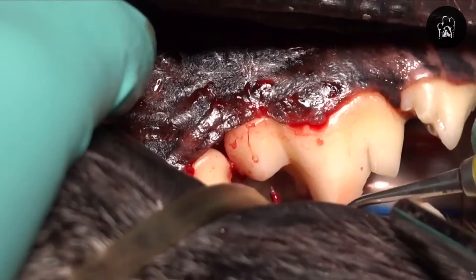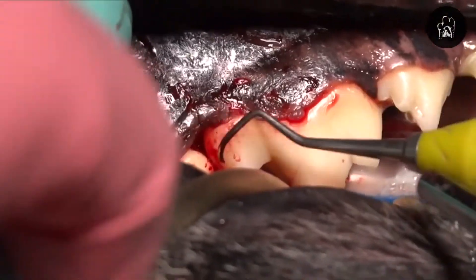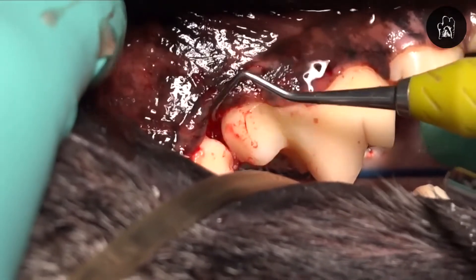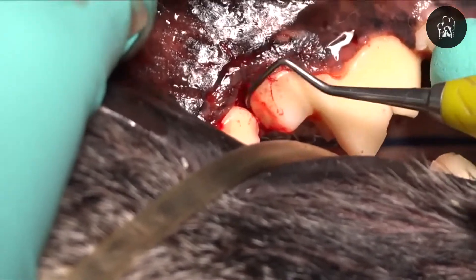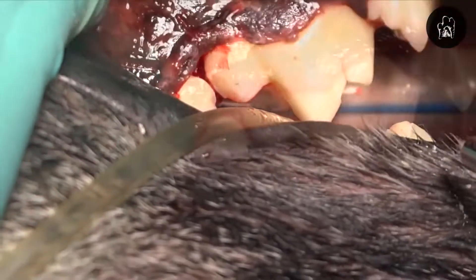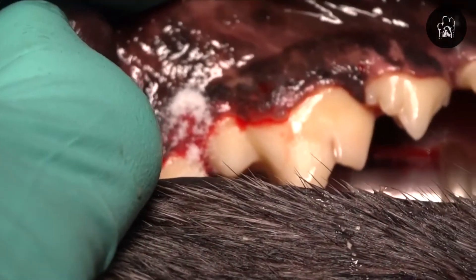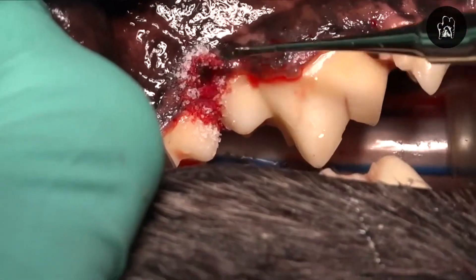By removing that and then using a bone grafting material to replace that granulation tissue and potentially form a matrix for bone cells to grow into, we're not only eliminating the existing pathology, we're creating an ideal environment for the bone to regrow in that area. And we'll show you another defect here shortly that we have post-op radiographs of with follow-up down the road that demonstrates that.